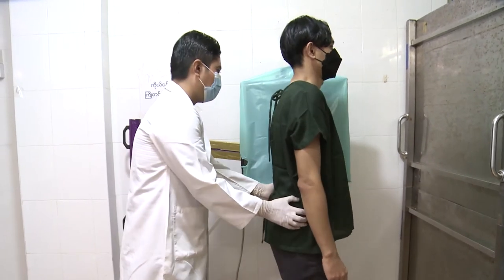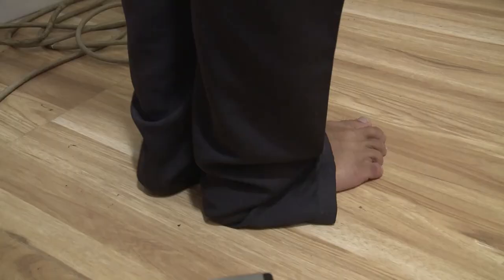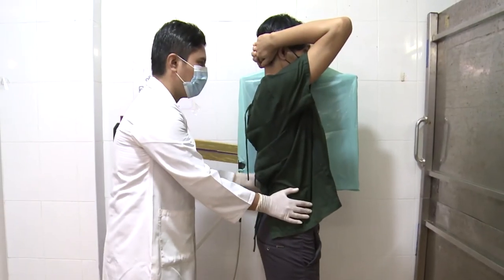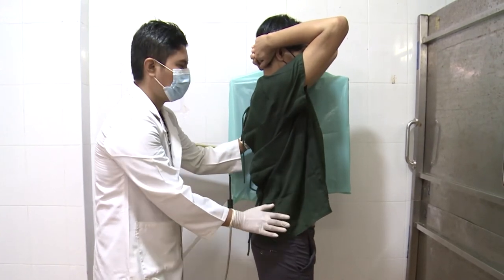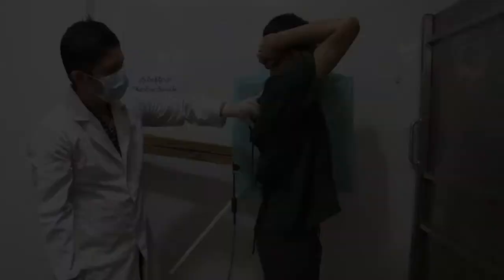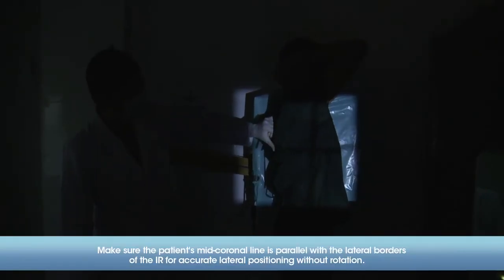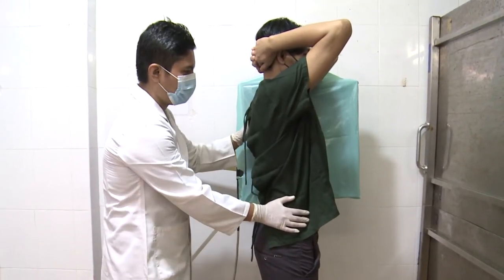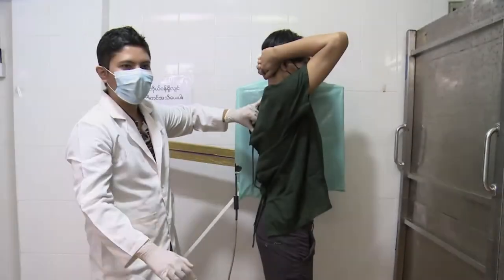3. To take a chest x-ray in the lateral position, have the patient stand upright with their left side against the IR plate. Ask the patient to spread their feet slightly to evenly distribute their weight. Check that the upper border of the IR is approximately two inches above the patient's shoulder. Have the patient raise their chin to prevent superimposing lung apices. Position the CR at the nipple line and check that the alignment of the CR and IR are centered. Ask the patient to raise their arms and rest their hands on their head. Place the right or left marker on the upper corner of the IR. Collimate the four sides of the lung fields. Ask the patient to not move, then go to the control panel to take the x-ray.